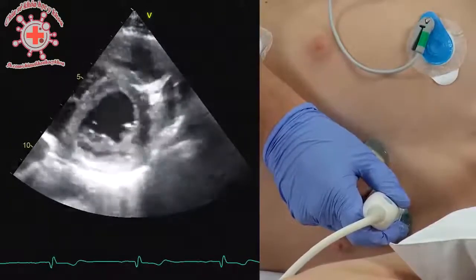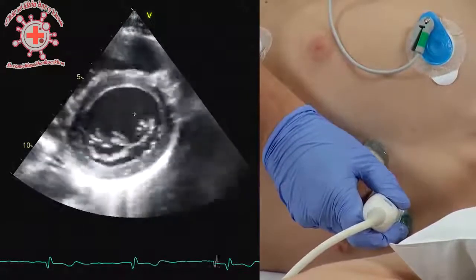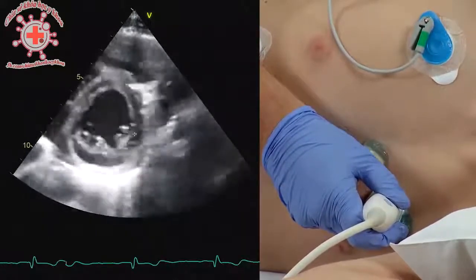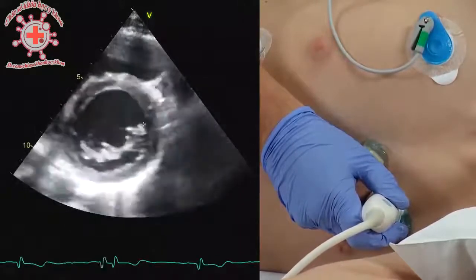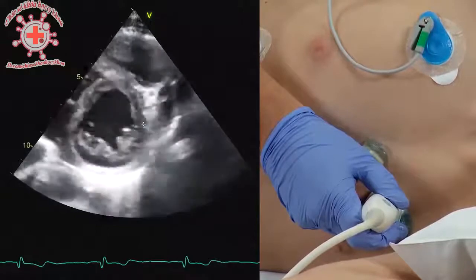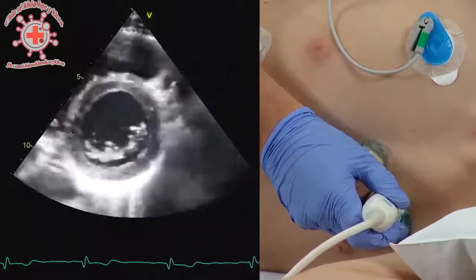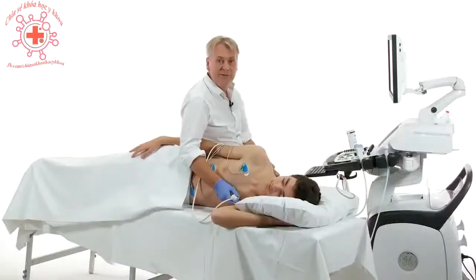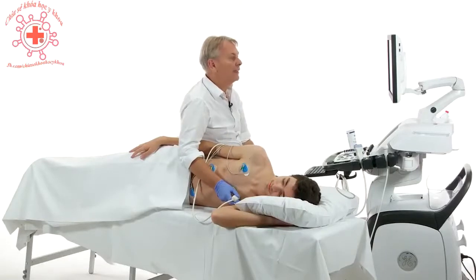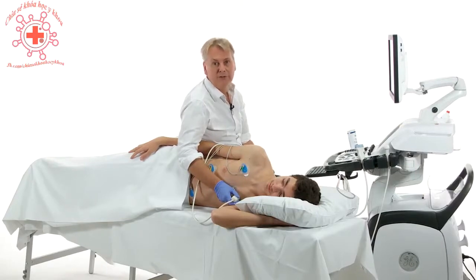And here you would nicely see the mitral valve open like a fish mouth, with the anterior leaflet right up here and the posterior leaflet here. Note that you can nicely appreciate the anterolateral commissure. That's where the anterior and the posterior leaflets meet close to the lateral wall, and the posterior medial commissure, which is right here. This is a very important view if you want to exactly localize, for example, a mitral valve pathology. We'll talk about that later in the chapter on mitral valve.